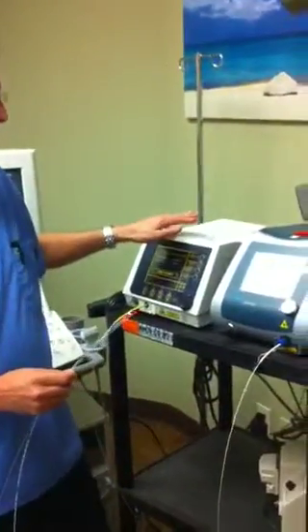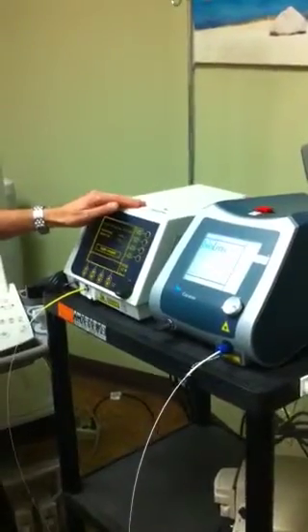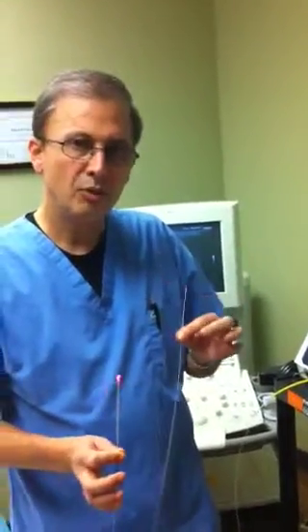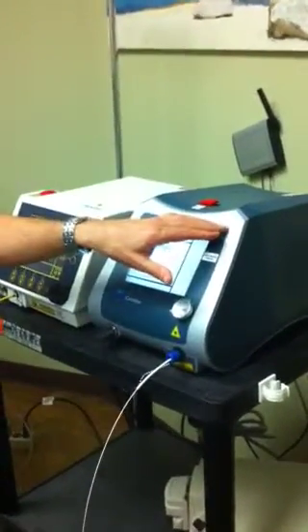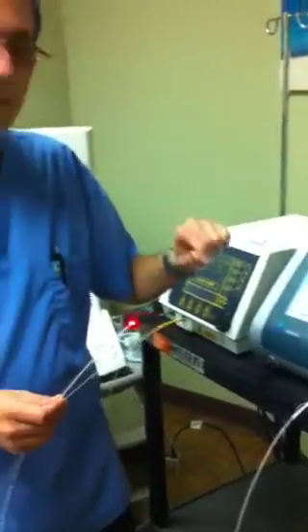For about 10 years we were using the 980 nanometer laser for ablation, which comes with this type of fiber. We recently switched to the Ceralas E15 1470 and I want to explain what are the advantages of this.